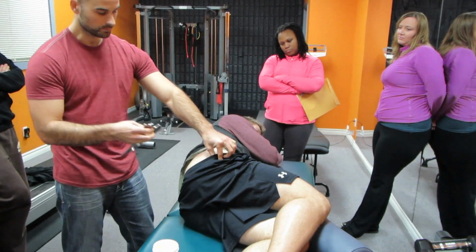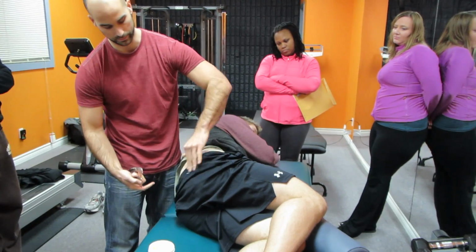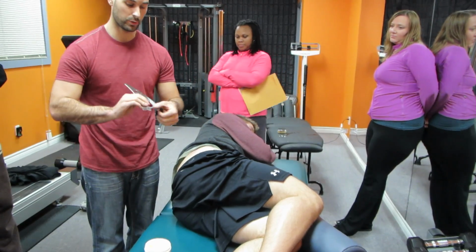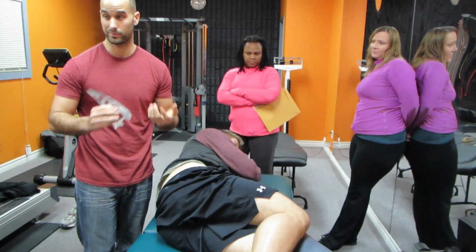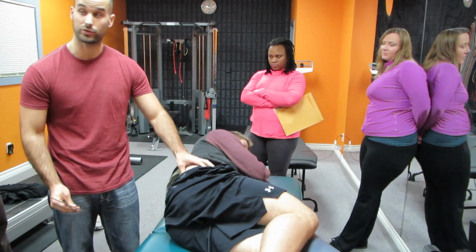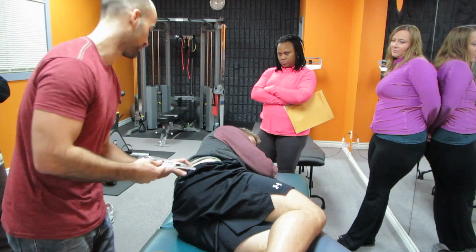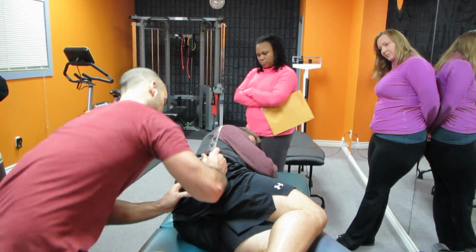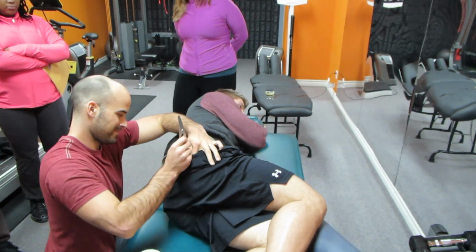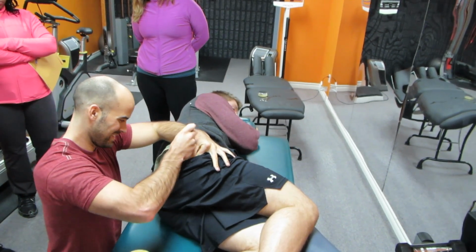From there, if we want to get into piriformis, it kind of runs in this direction here, right? So we're going to do our best. I always tell everybody, we're not going to be exact with where everybody's piriformis is, not all the time. We're going to know the general area that it is, and we're going to try and follow it. It really comes down to what we're intending to treat, and we're going to hit some of it no matter what, right? So if we fall off the back, we can come back. We're actually just going to treat this whole area in here with this guy.